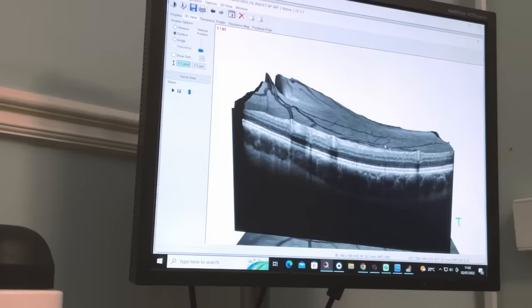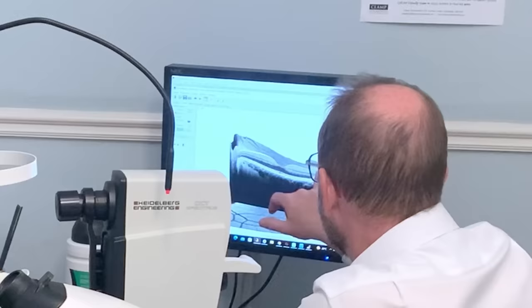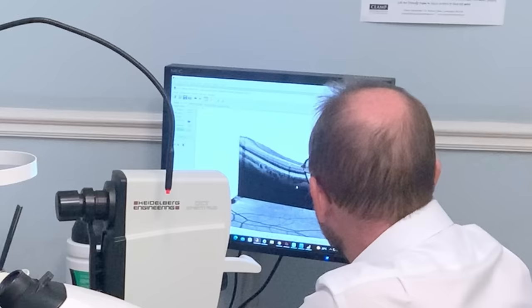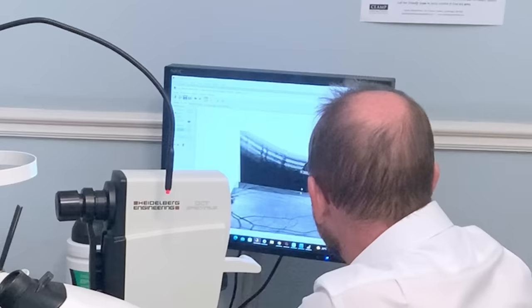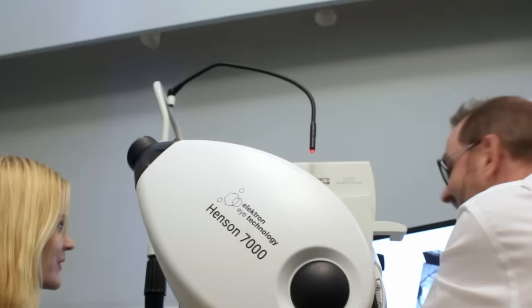Rotate it. So again here, just going through the layers of the retina, and then that's the centre there as well. So that looks good. Richard will have a look at these when he does your sight test, just to make sure he's happy with them. But that looks really healthy. If we look from above, you see how sharp the vessels are there. Wow. They're going out the back of the eye, and that's feeding the oxygen to your retina. It's quite cool. It's really great showing people.